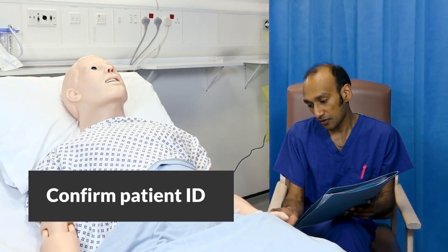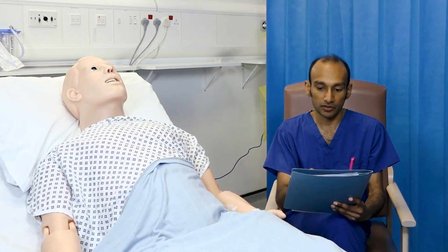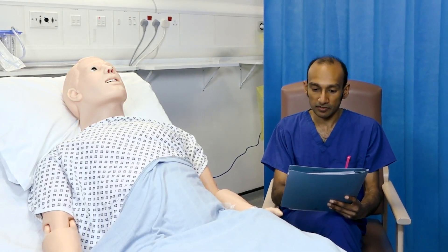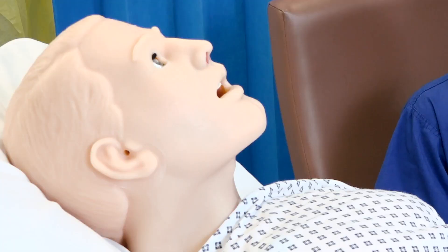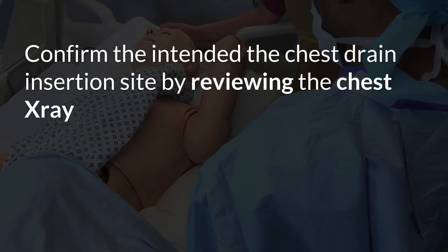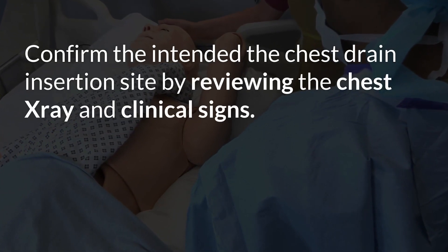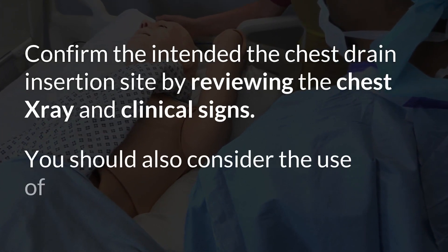Confirm the patient's identity via their wristband. Confirm the intended chest drain insertion site by reviewing the chest x-ray and clinical signs. You should also consider the use of ultrasound.